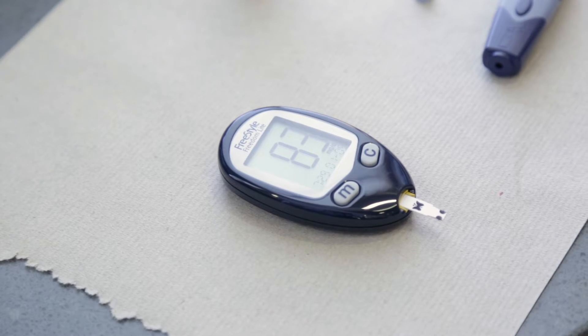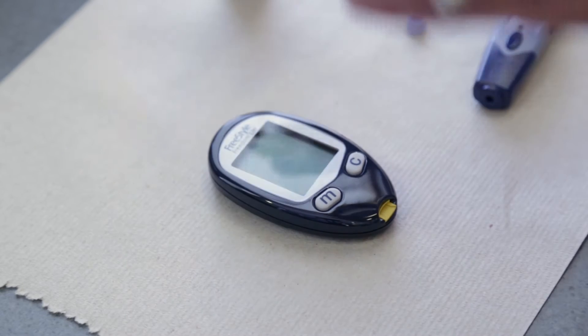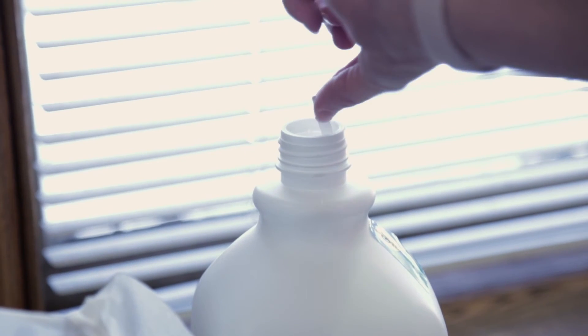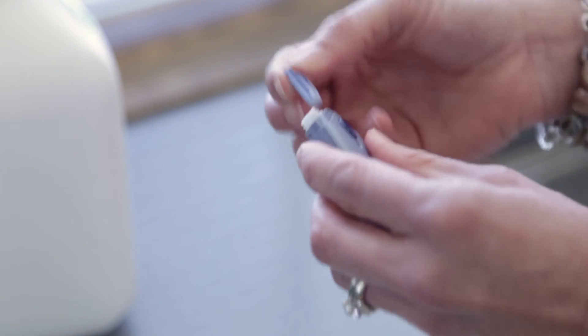After the results appear, discard the test strip and lancet by removing the lancet from the device and placing it in a puncture-proof container, such as an empty milk jug or laundry detergent container.